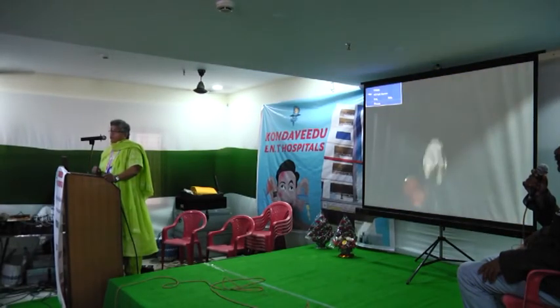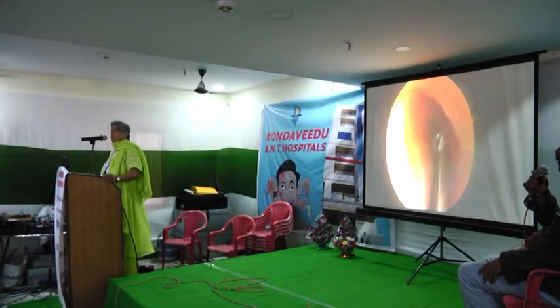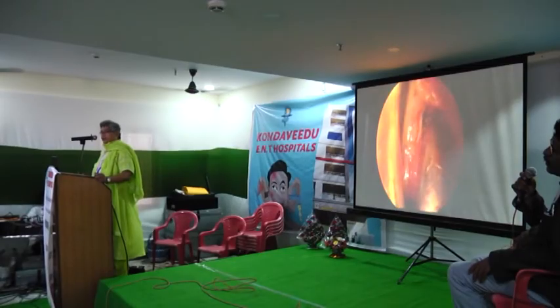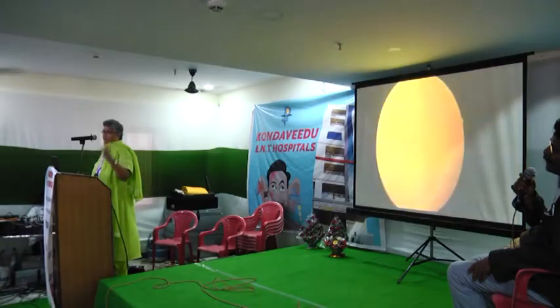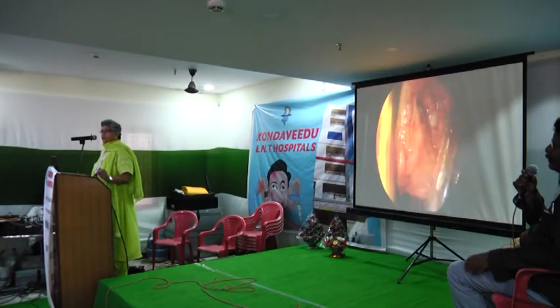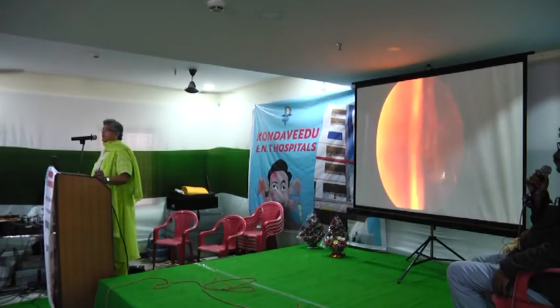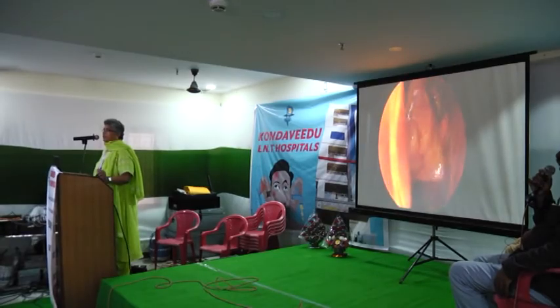Failed external DCR. See, a child on whom I did external DCR 3 or 4 years ago has failed. I revise it to see why it failed, again taking the help of ENT people. Are there any small adhesions forming inside the nose? If they can be easily tackled endoscopically, instead of subjecting the baby to another major surgery, a repeat external DCR, the child can be posted for a small endonasal surgery and the adhesions can be removed.